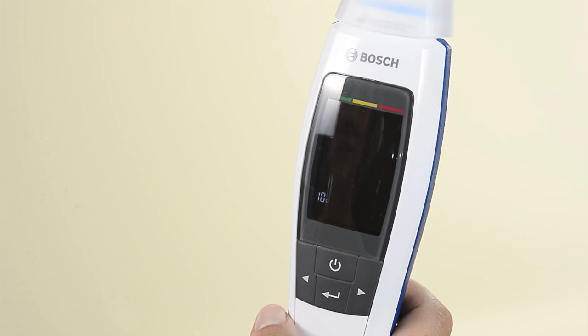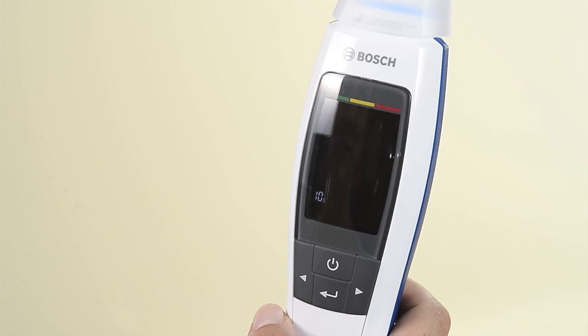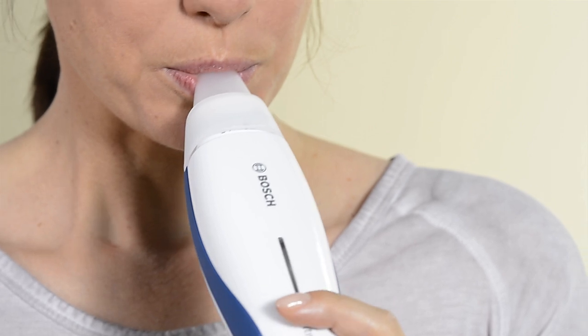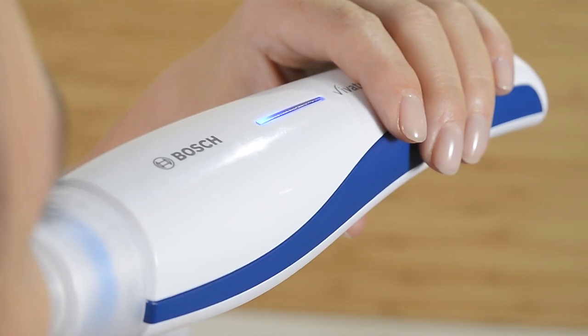This is how it works. Relax and inhale deeply through the mouth. Place the device to your mouth so you can see the LED light, and exhale evenly, as if you were gently cooling down a cup of hot tea.